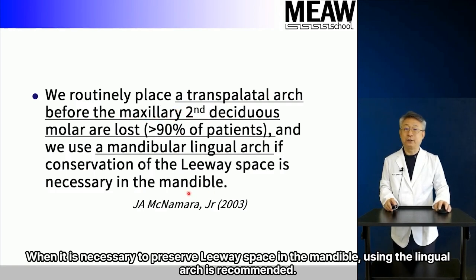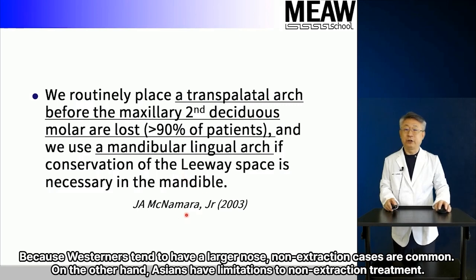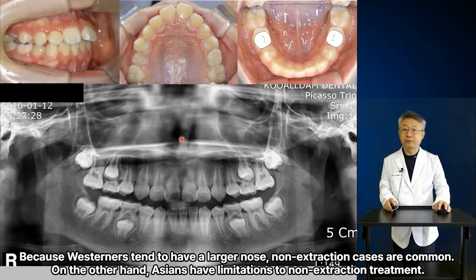When it is necessary to preserve leeway space in the mandible, using the lingual arch is recommended. Because Westerners tend to have a larger nose, non-extraction cases are common. On the other hand, Asians have limitations to non-extraction treatment.